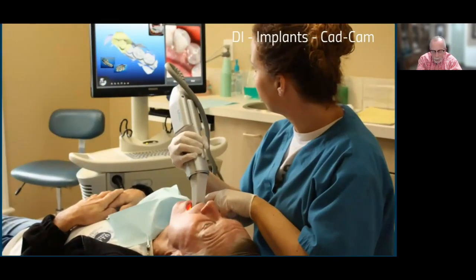This was a system that I had developed in my career, where we partnered with some specialists that we worked with on implants. So I had, I think, about 8 surgeons and about 4 periodontists around the Carolinas that we worked with. We worked with the scanner companies, and we got the scanner that they wanted in their offices, and our specialists would place the implants, put the scan post in there and scan it, and then send the file to the laboratory.